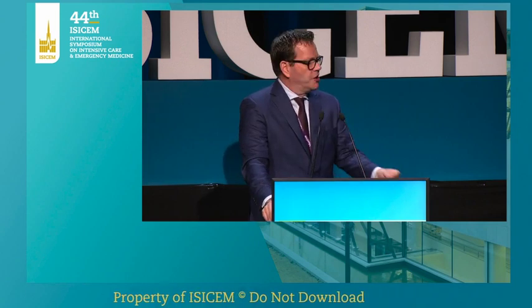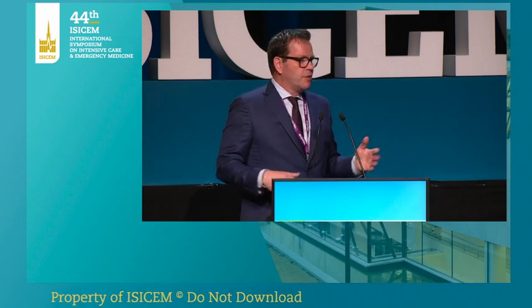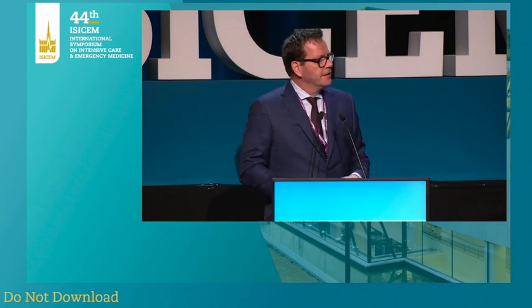Great question, thank you. I think this is also where we can personalize things. There are some monitors that we apply to every patient. Every patient gets pulse oximetry, every patient gets capnography, but as you get more complex and they're more invasive and have risk for them, then we need to tailor what we're doing for an individual patient. So I think that we should be measuring compliance.